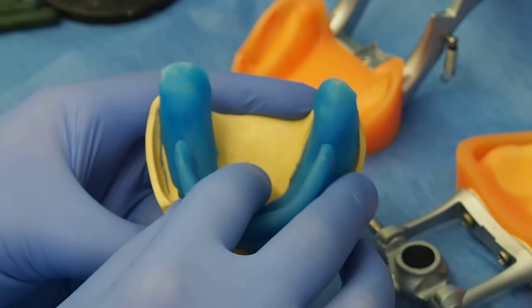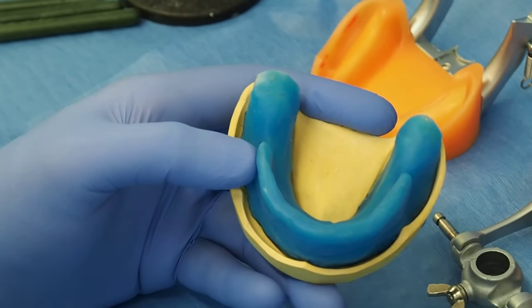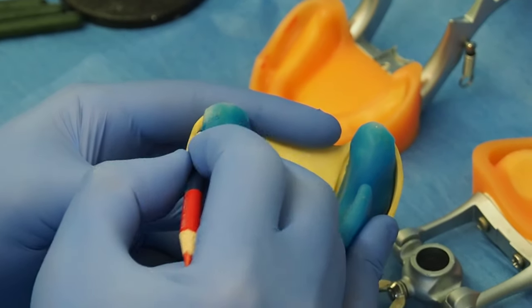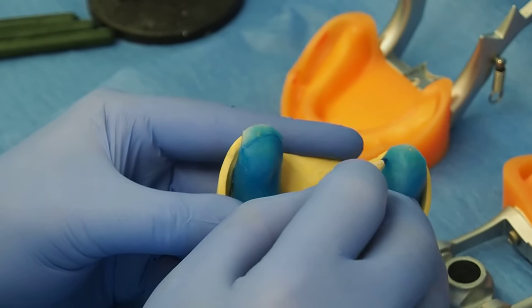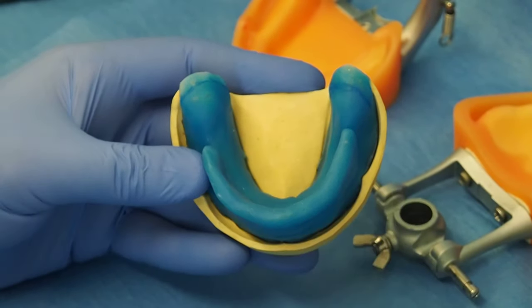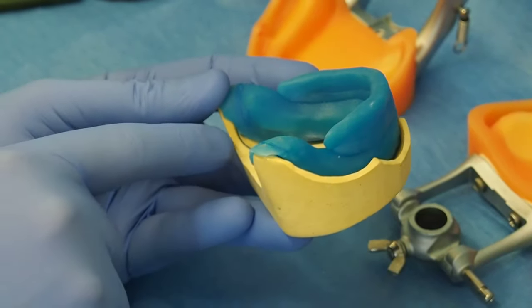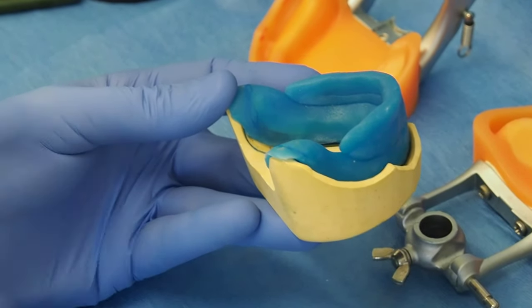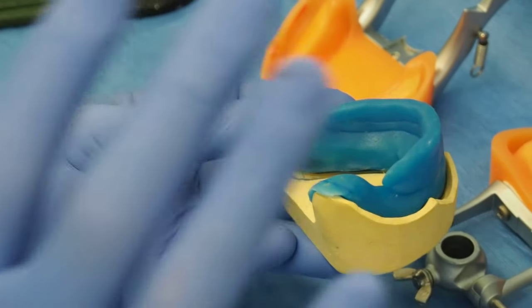So this one here is way overextended. The easiest thing to do is just mark where you need to trim. And remember, if you fall short a little bit in the tray, it's okay. It needs to be short. Remember, like on this case here, it needs to be short, so I'm not going to trim anymore right there because I already have it short.